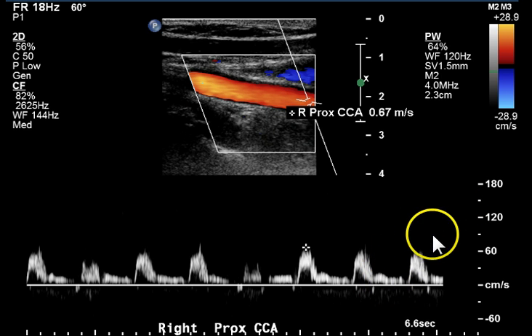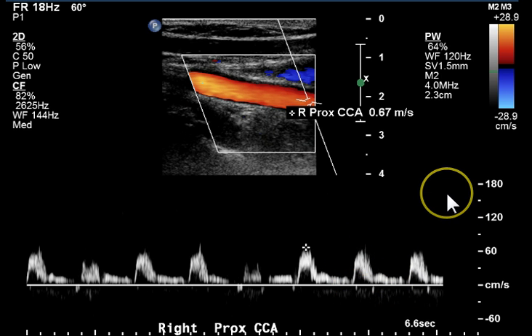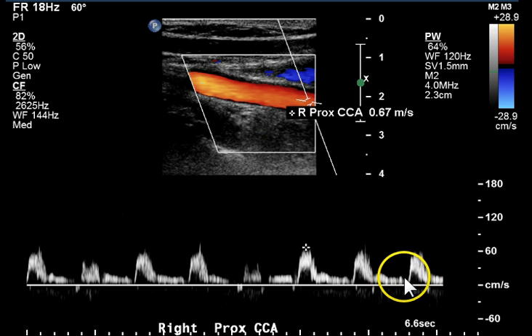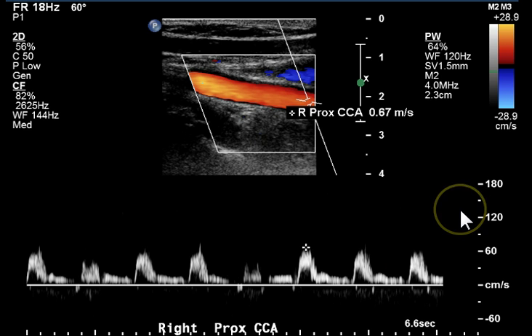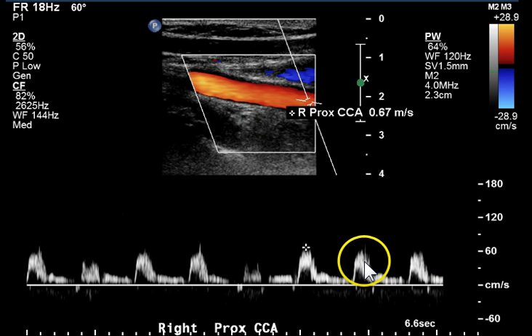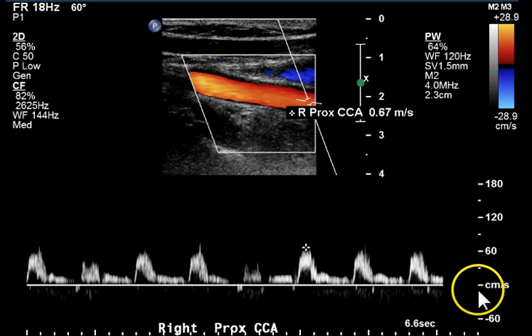Whenever we see Parvus Tardis, we think about disease upstream. When we see low pulsatility or high pulsatility in a vessel that should have low pulsatility, we think about disease downstream. So we may see some disease in further images based on this waveform.